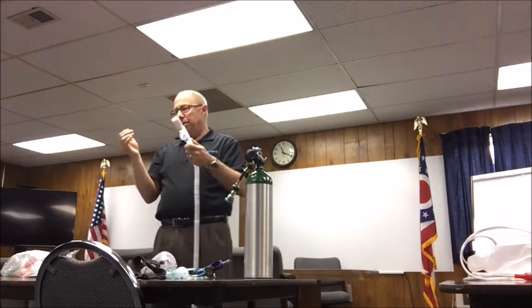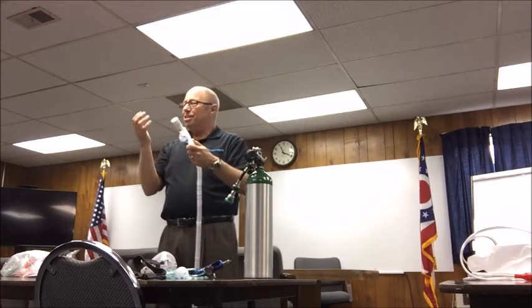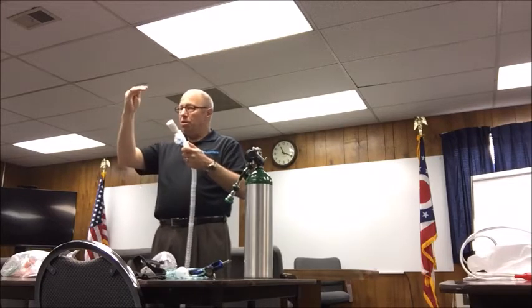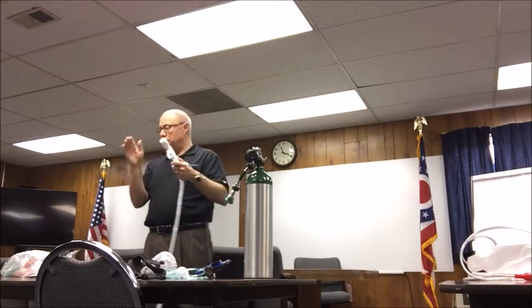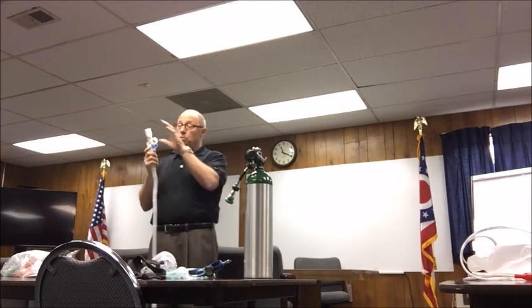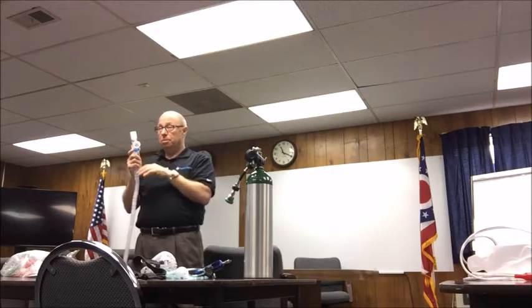You're going to cure about 40 to 50% of the patients at 5 centimeters of PEEP, quite honestly, but it gives them that time to start getting acclimated to that pressure. And every time we increase the PEEP pressure, we increase the work of breathing. I challenge you all to put this on and start at 5 and work your way up to 10. Because when you get to 10, it's almost like breathing against that wall. It is really hard to breathe against.